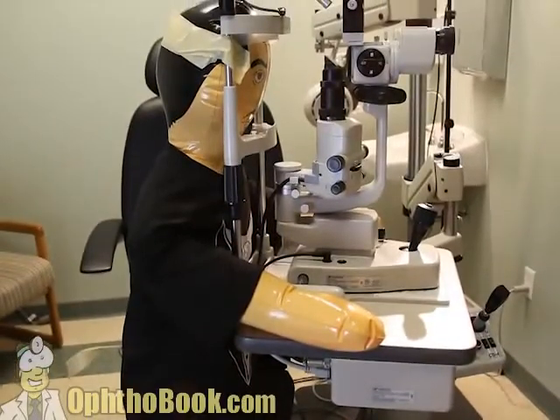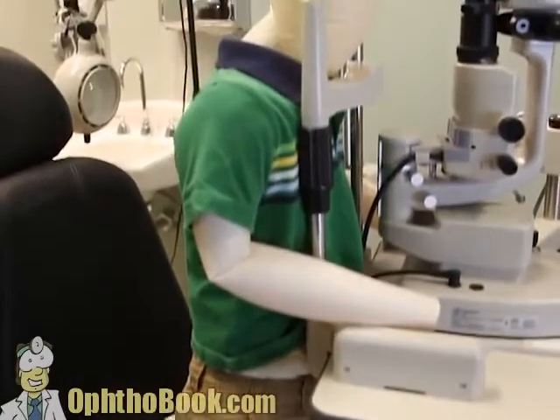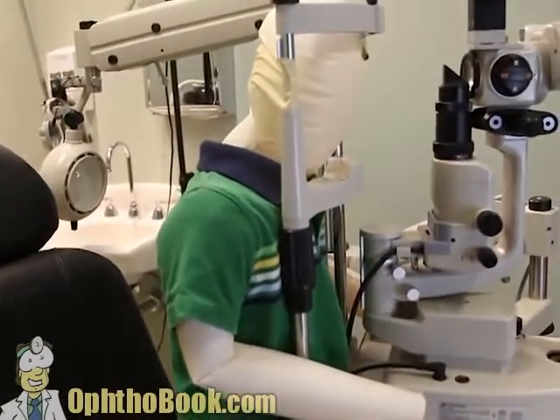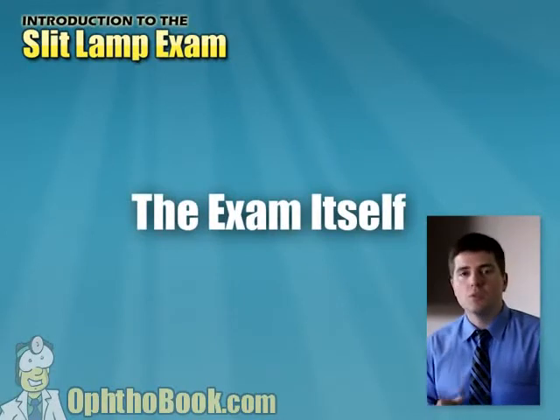microscope. And of course, with children, they're very limber, but they have short torsos, and so it's helpful to have them get on their knees and then get up to the microscope that way. And a lot of kids do great with this. All right, let's move on to the exam itself.